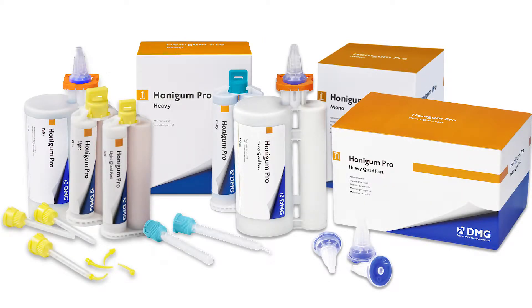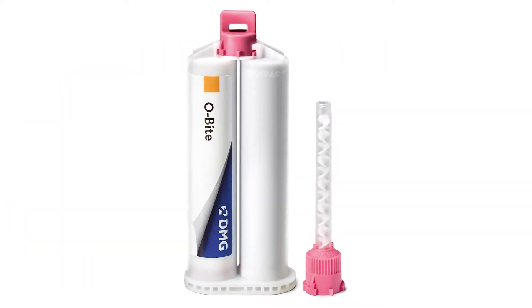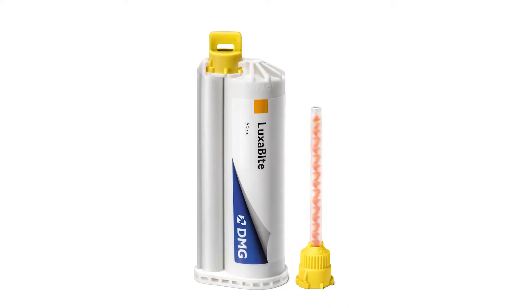We're not talking about the actual impression material, but the Honeygum Pro is very good for capturing a polyvinyl. If you're doing polyvinyl impressions to get the accuracy, be sure to capture the second molars if you do that. We're going to talk a little bit about the obite and also about the luxabite.